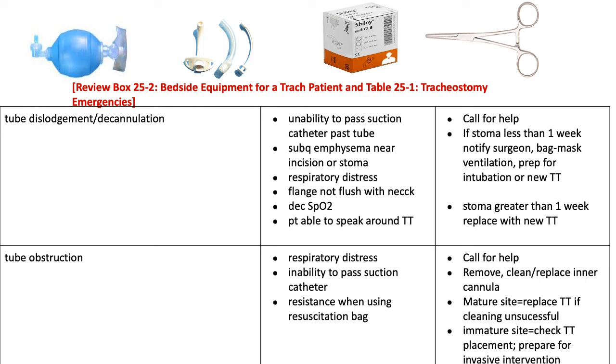So if the tube is accidentally removed, that opening can close rather quickly. So it's important to act quickly and promptly should this happen.